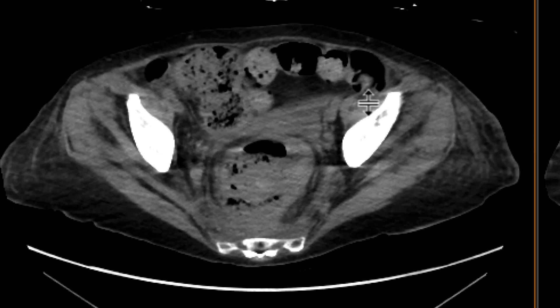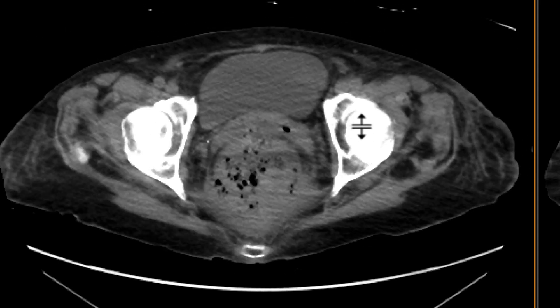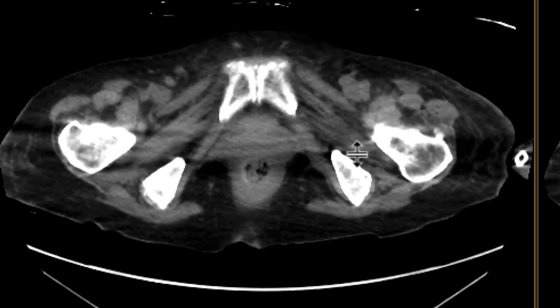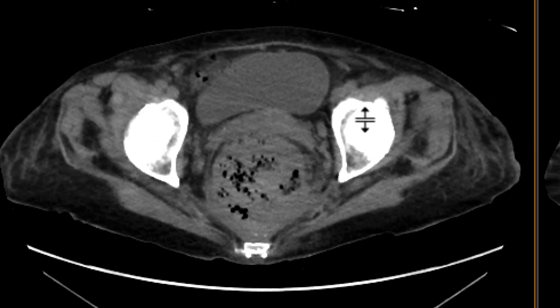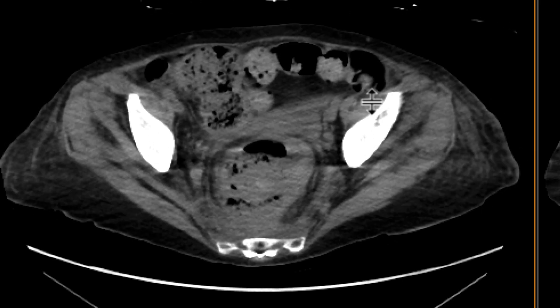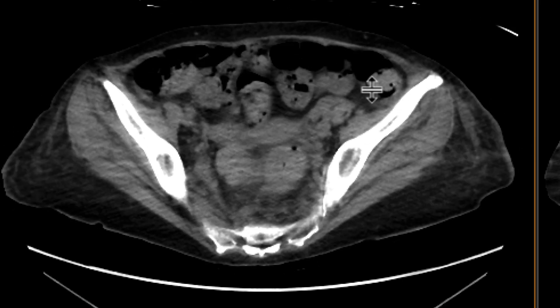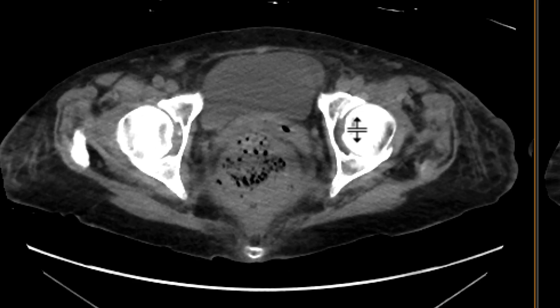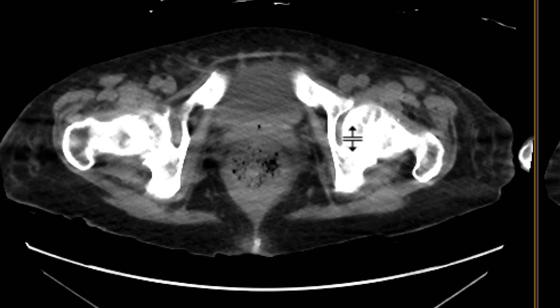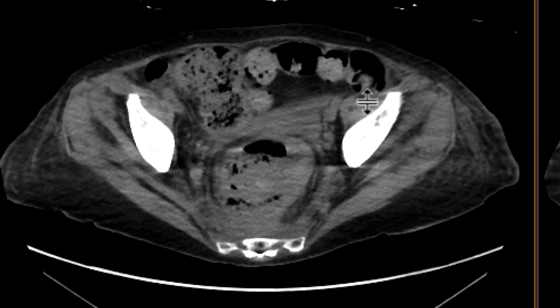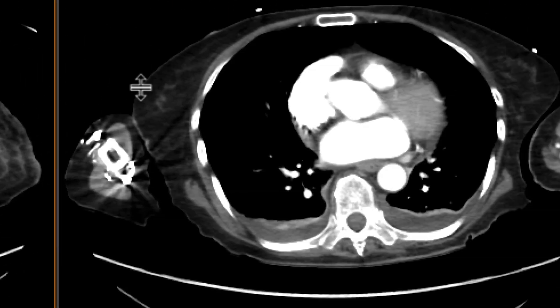As we scroll downwards, we notice that the rectum looks very abnormal. It's distended with stool, with lots of inflammatory change. We're going to investigate that a little bit further as we go through the other phases.